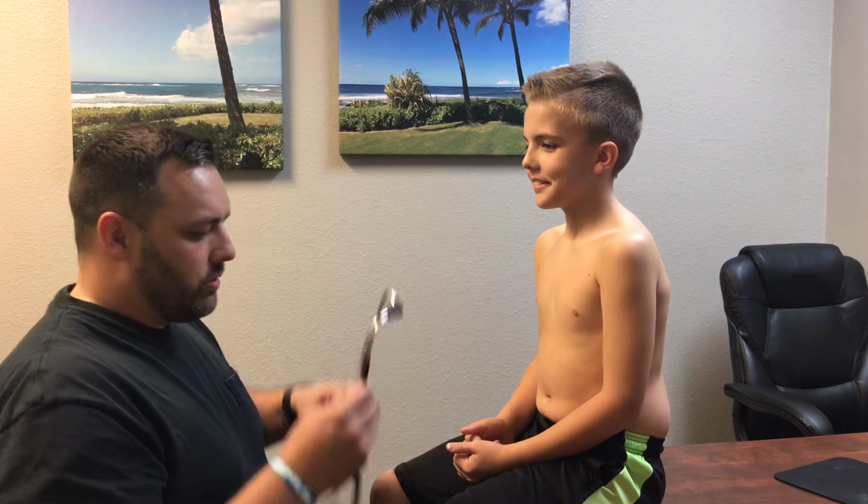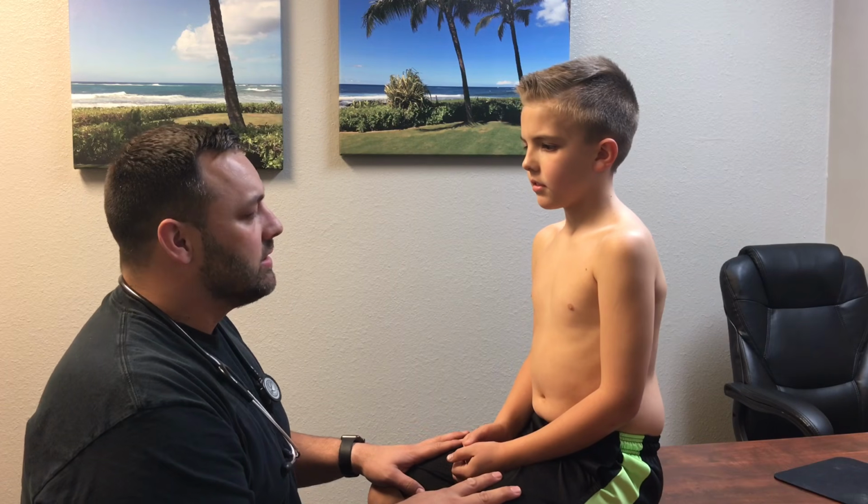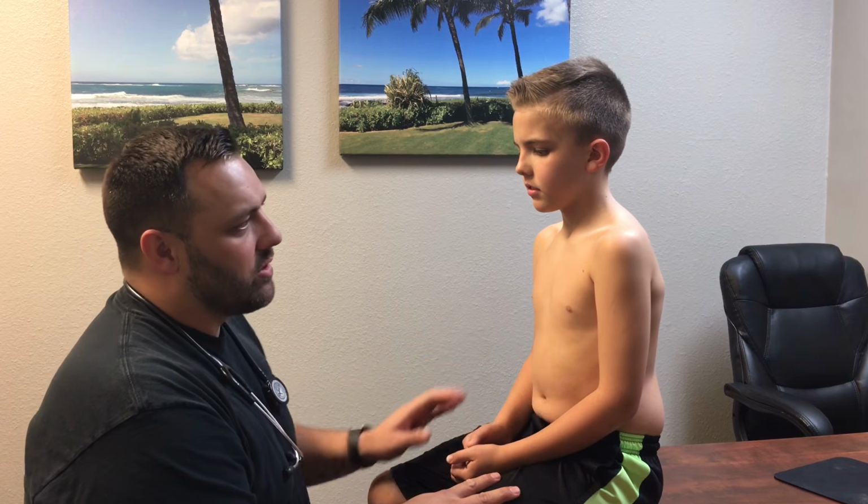Hi. Okay. All right. So the first thing we want to do is have him sitting up. You could do a couple of things laying down as well. I don't have the bed to do that here, so we're going to do everything sitting up. But the first thing I'm going to do is listen to his heart.